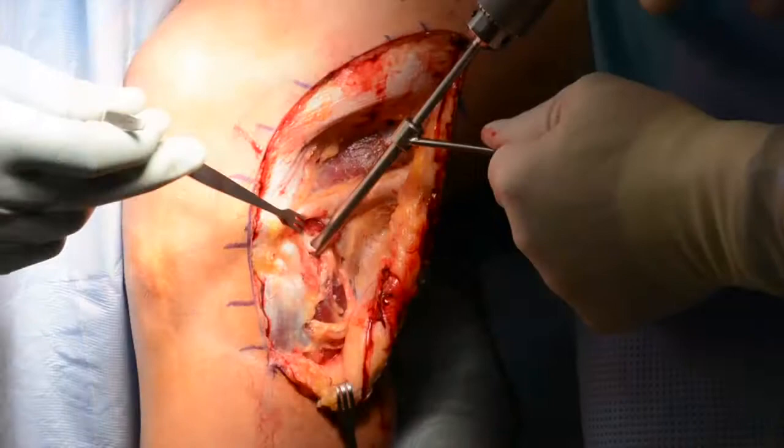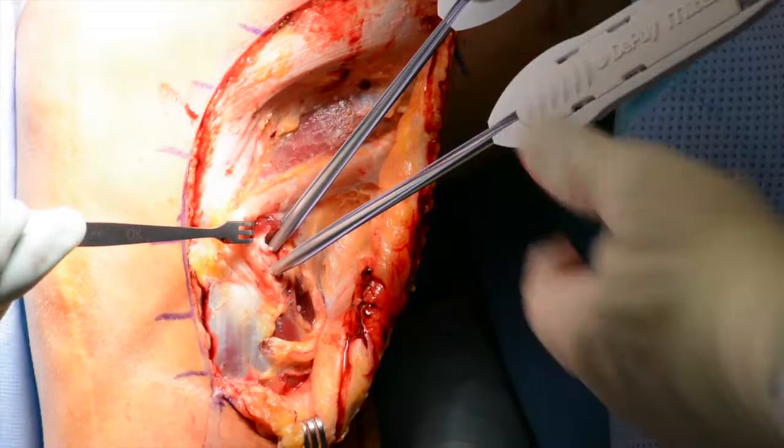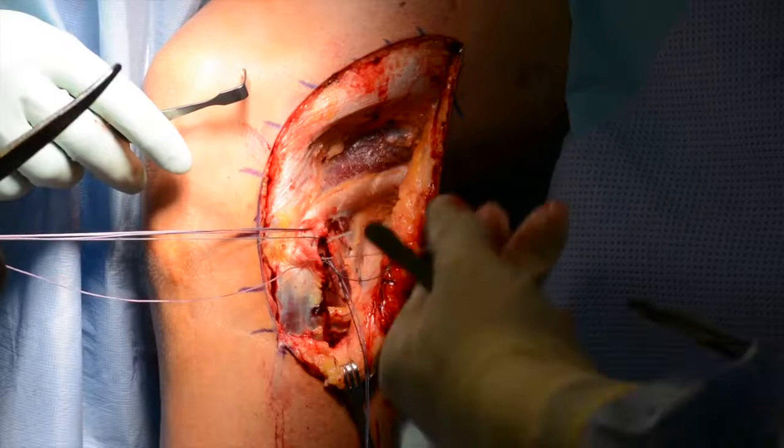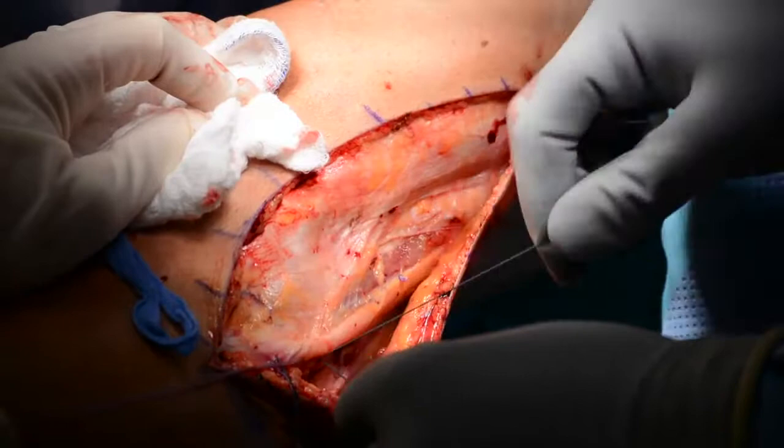Two Mitek suture anchors are then placed into the fibular head, and repair of the direct arms of the long head and short head of the biceps femoris upon the fibular head and styloid is then conducted. These sutures are then passed into their respective portions of the long and short head of the biceps femoris tendon. The sutures are tensioned to assure firm grasp on the tendon. This anatomic repair is performed with the sutures tied with the knee in full extension.